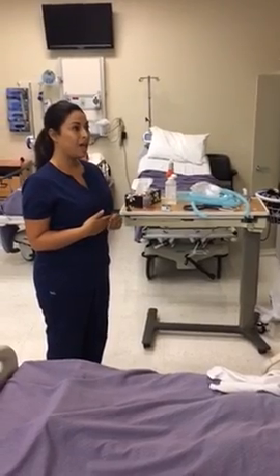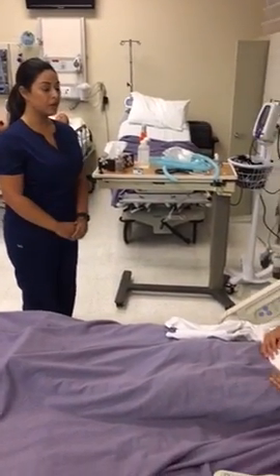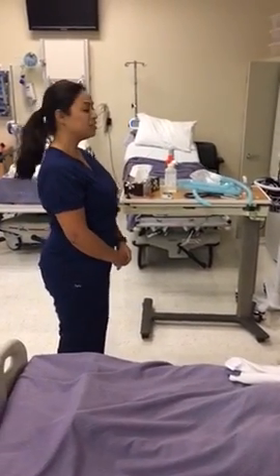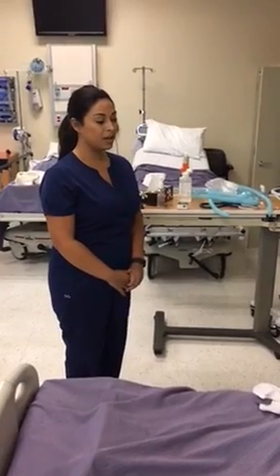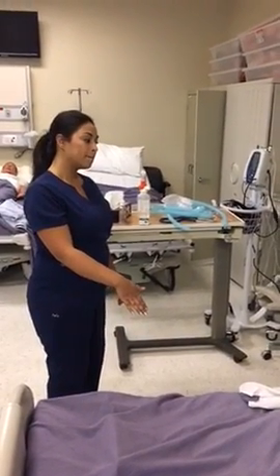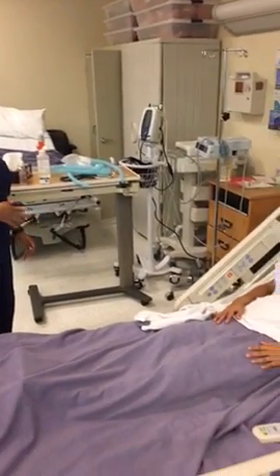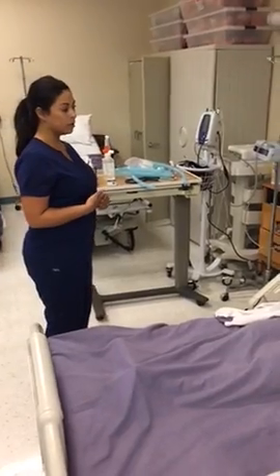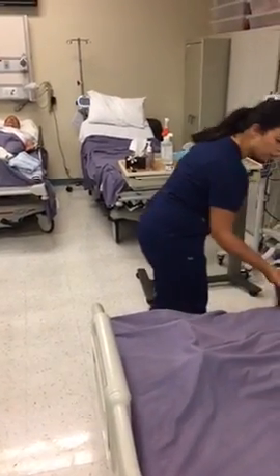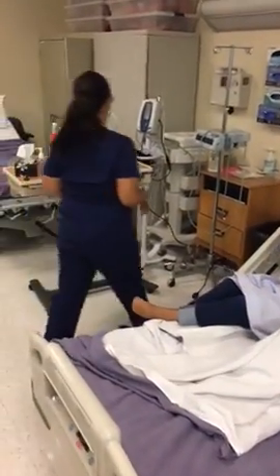Okay. And do you have any questions at this point? No. Okay, and you understand the procedure? Yes, I do. Okay, great. Thank you. I'm also going to be getting a set of vitals, so I'm pretty sure you've had these done. I'm just going to ask that you come to the edge of the bed, and are you able to do that? Yes. Okay. Do you need any help doing that at this time? No, I think I can do that. You're good? Okay, perfect. And the bed's at a good height for you? Okay. So I'm going to go ahead and get some gloves on, okay? Thank you.